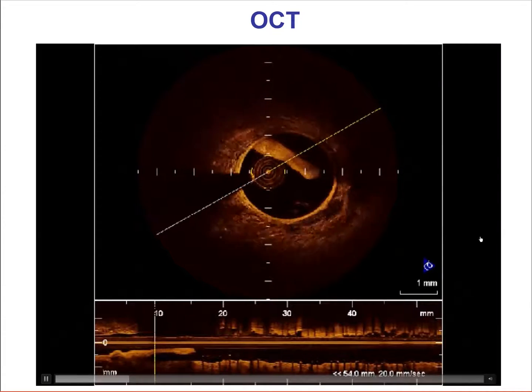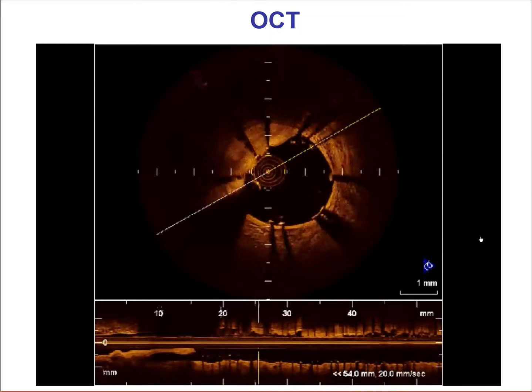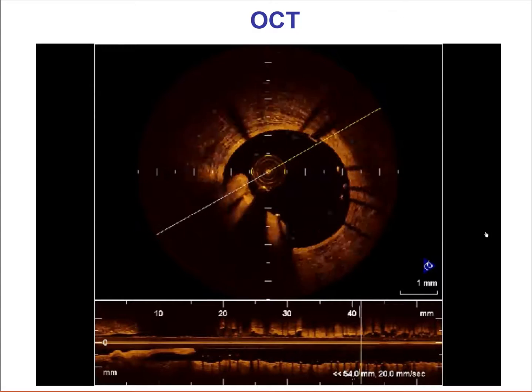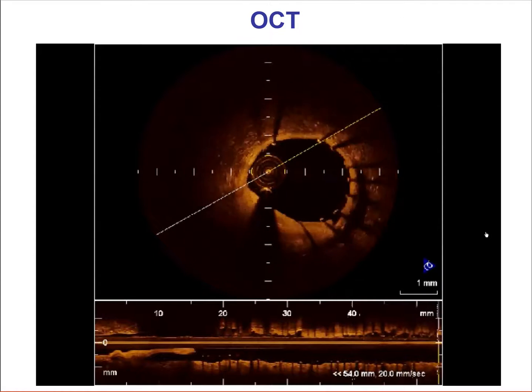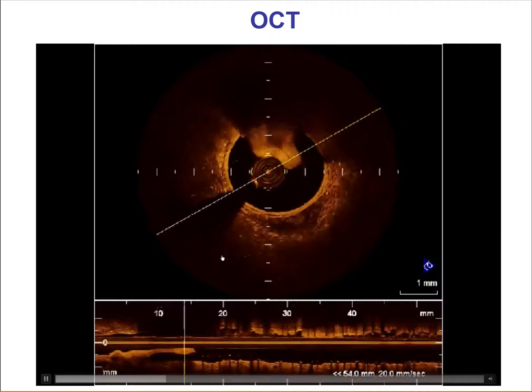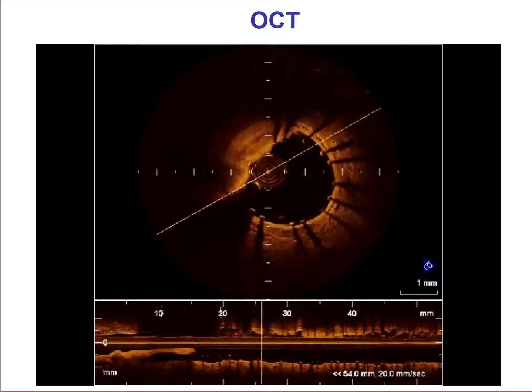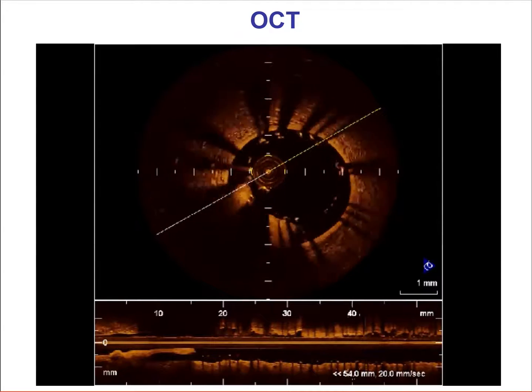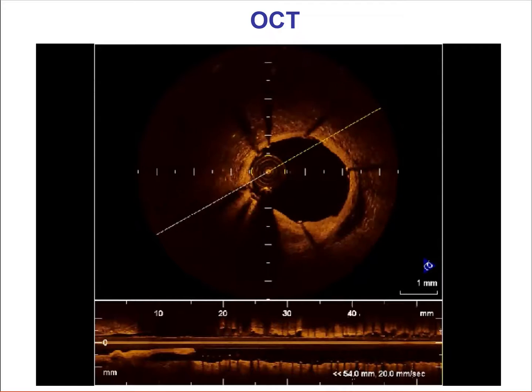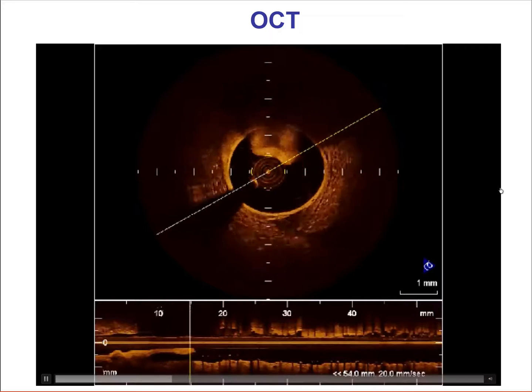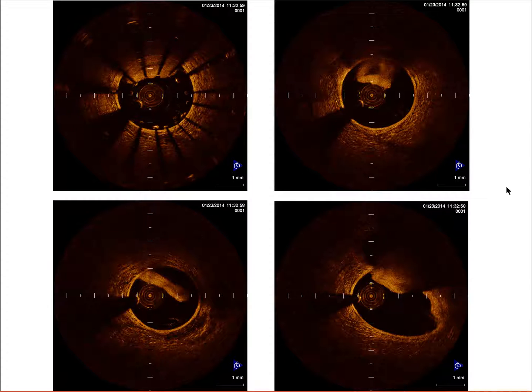By rewiring and inflating with the 1.5 millimeter balloon, we were able to restore flow into the three branches. We then performed optical coherence tomography to better understand the mechanism of the poor outflow after stenting. OCT revealed a dissection flap in the distal vessel, with good stent expansion and stent strut apposition in the more proximal parts. It appears the actual reentry point was further distal into the vessel than initially expected, with a compressed distal true lumen and a dissection flap extending further distally.